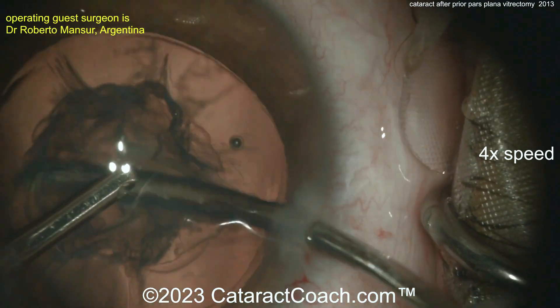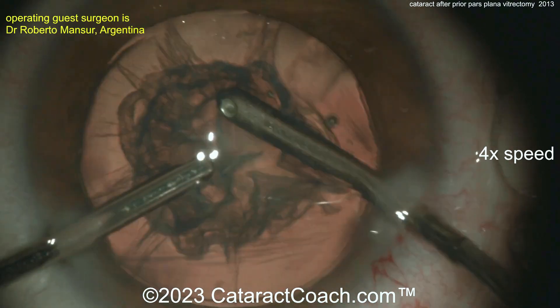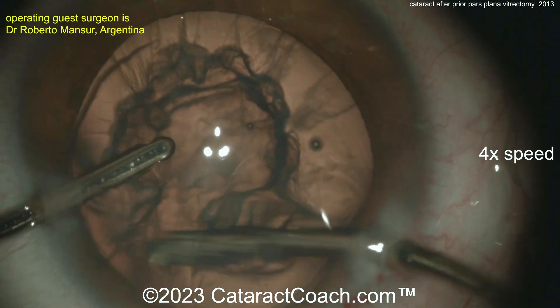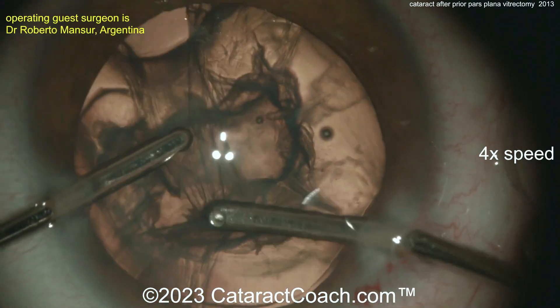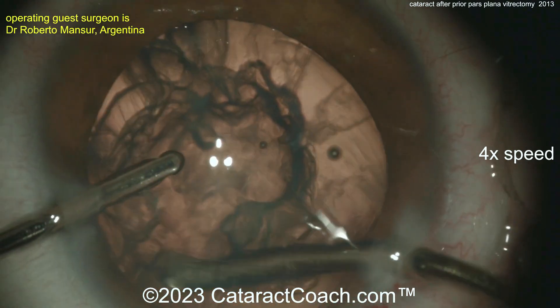You can see the surgeon here is not just doing bimanual IA to take out the lens material. Really don't want to do any hydrodissection here. The lens is relatively soft in this young patient, so just using a bimanual IA is going to be sufficient to remove all of the lens material.